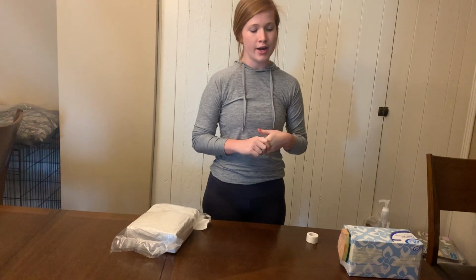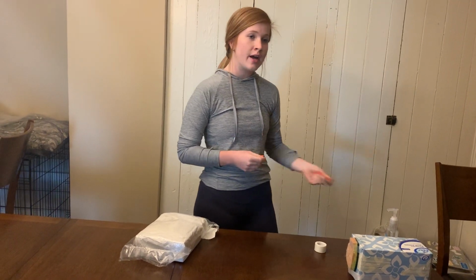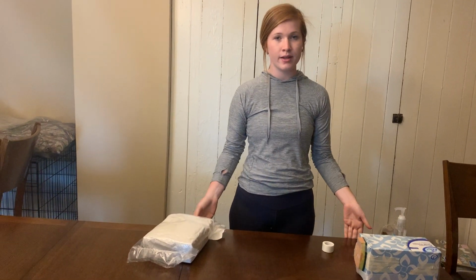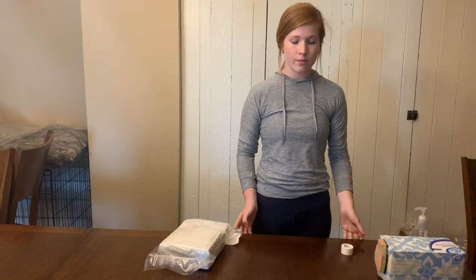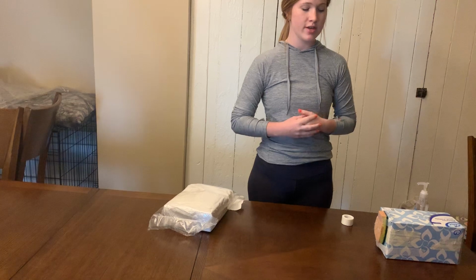I would explain the procedure to the patient, just let them know that I will be placing a catheter. It seems like they're having some trouble voiding, and this is just going to help to drain their bladder. Make sure that they understand that and make sure that they're willing to cooperate for the procedure. I would also provide for patient privacy and raise the bed to waist height for me to place this. Obviously, in these circumstances, I don't have a waist height surface.